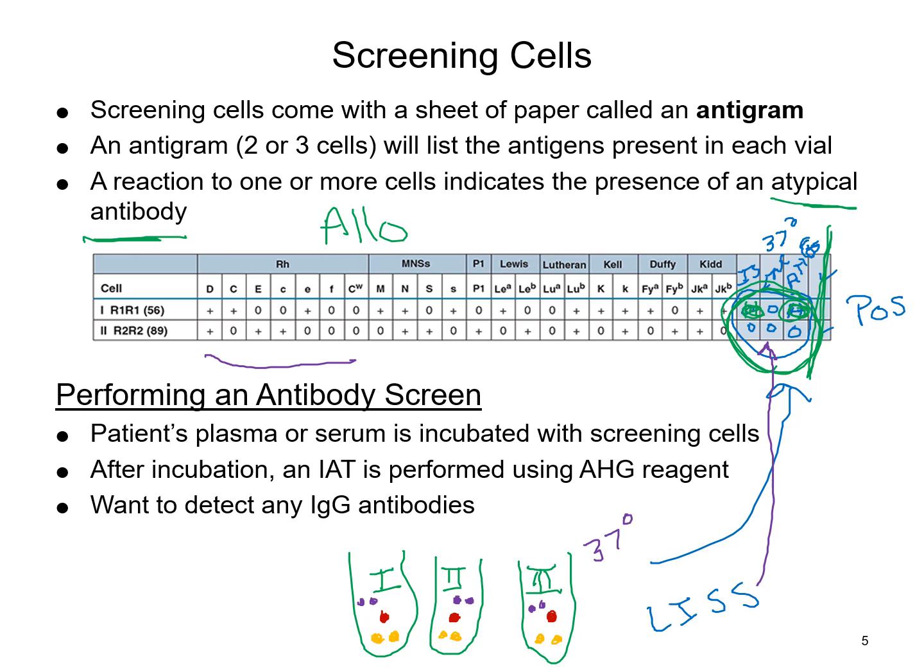And then after that, you would go through your next step, which again, remember what I told you happens before you go to that third step. You're going to have a wash phase. So you would use a cell washer, or you would manually wash it. And then after you've done your wash, you get that dry cell button.